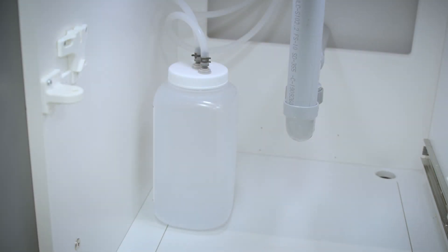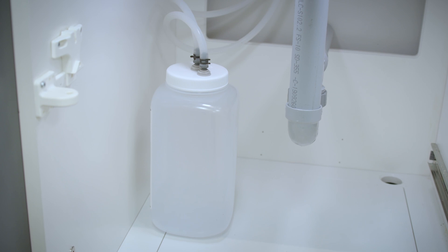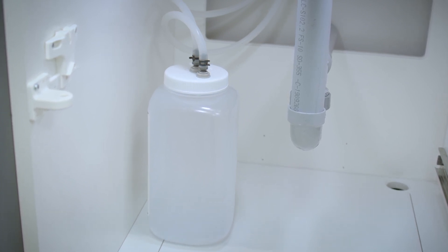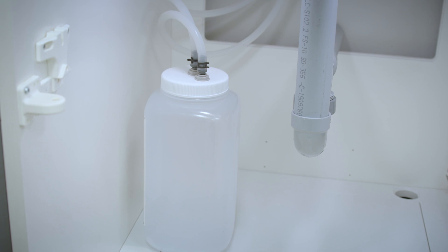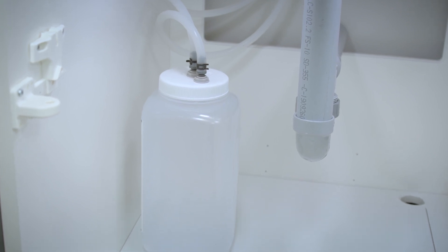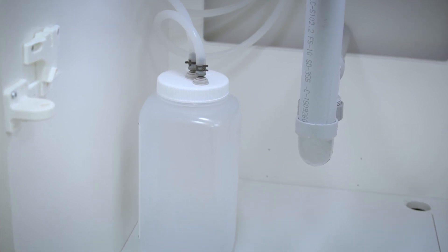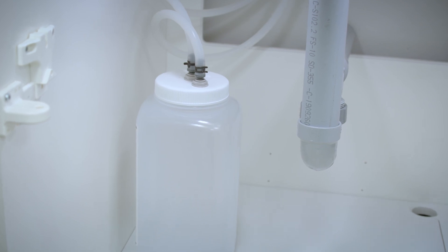The second drainage option is to use a waste bottle. Remember to carefully monitor the waste bottle to avoid overflow. The best practice is to empty the bottle every time you refill the water reservoir. When setting up the filling and drainage tubing, it is important to make sure the drainage tubes are not bent, crushed, or obstructed in any way.